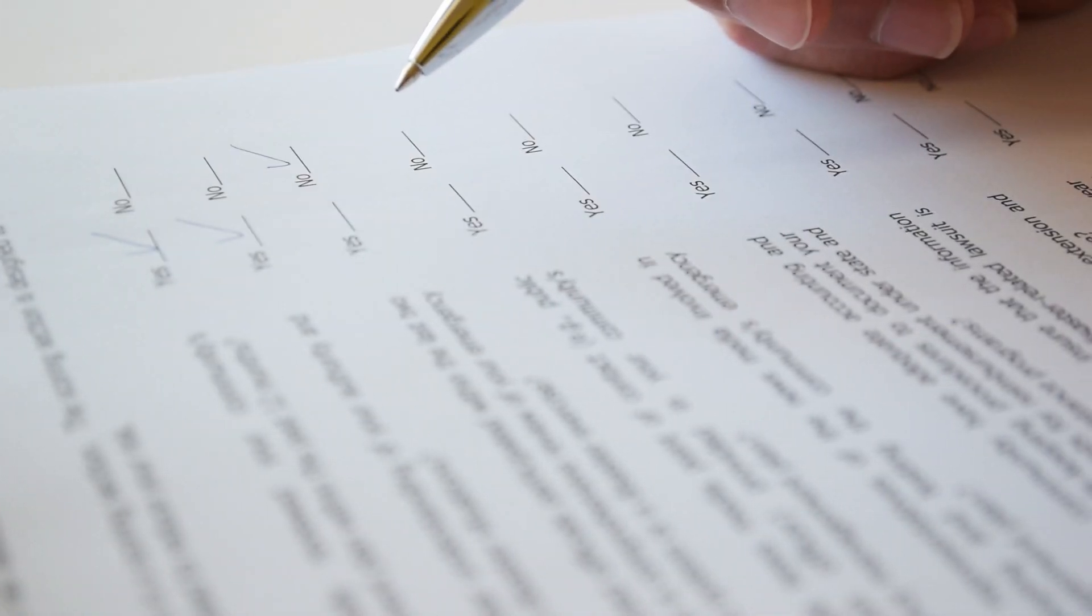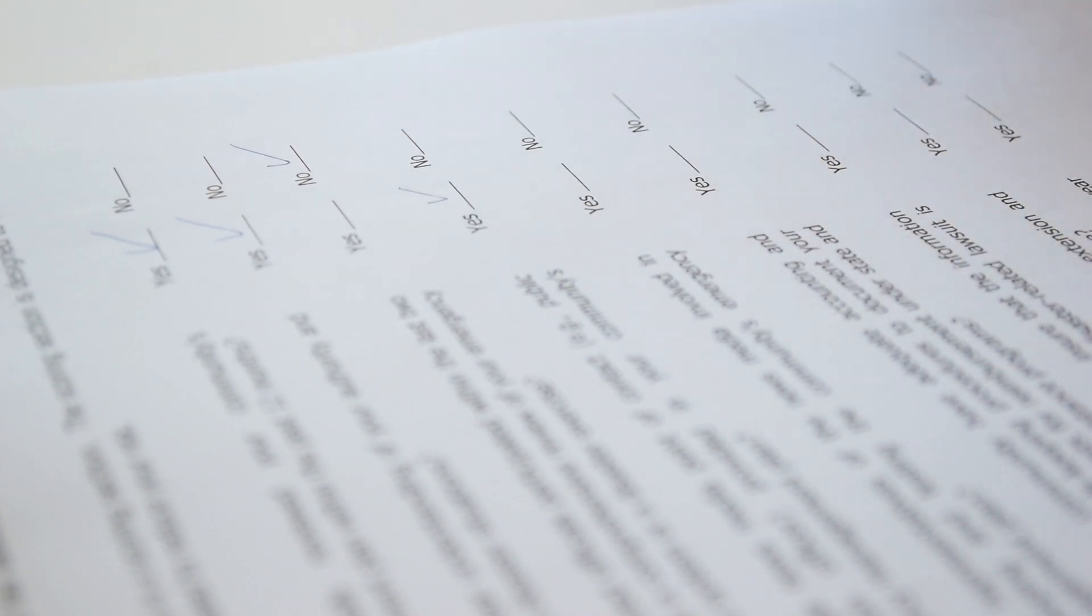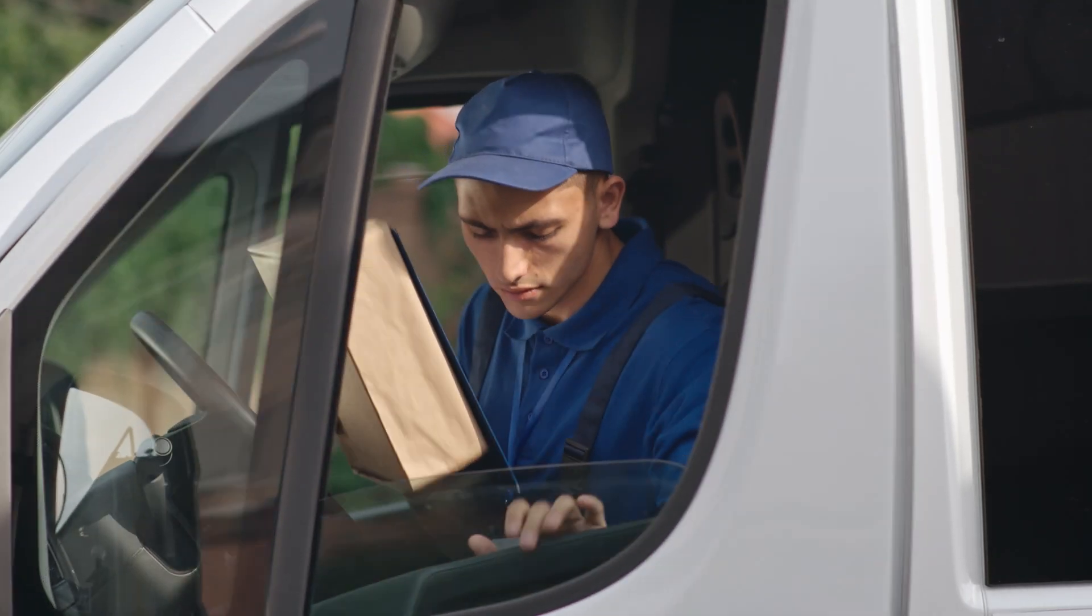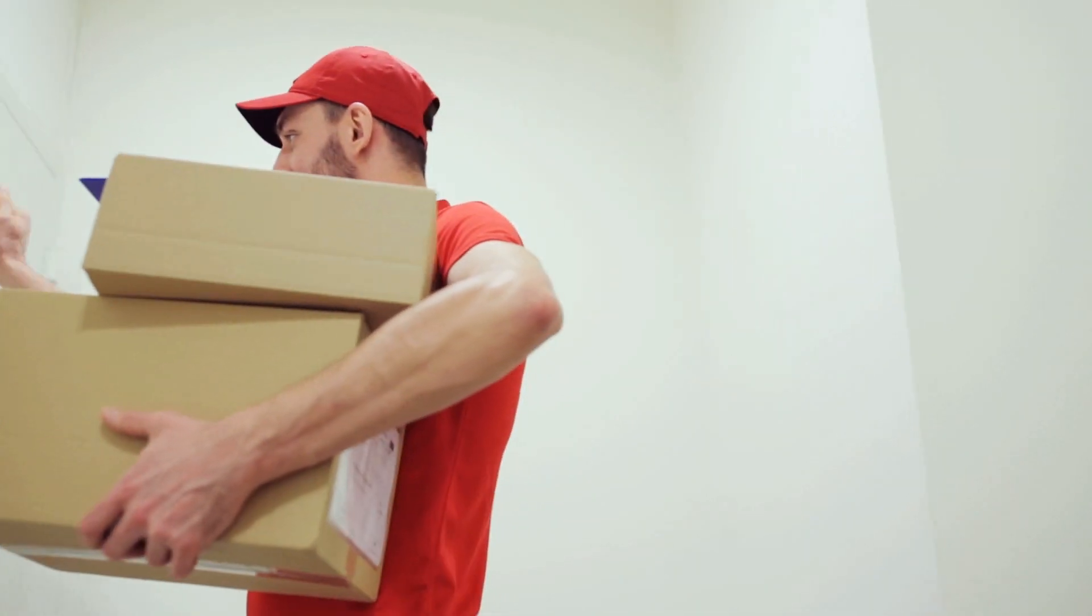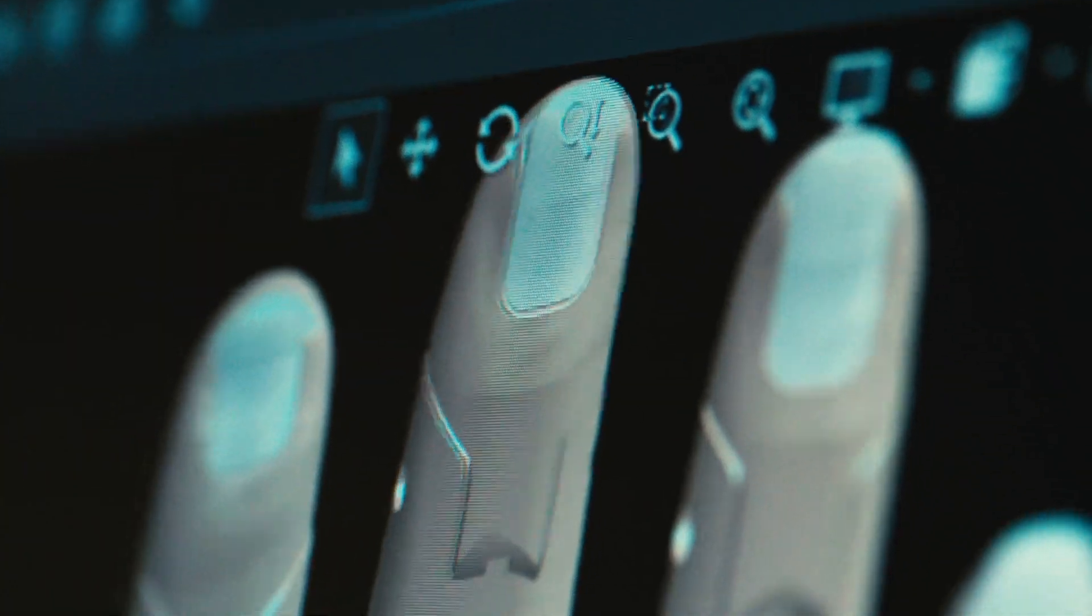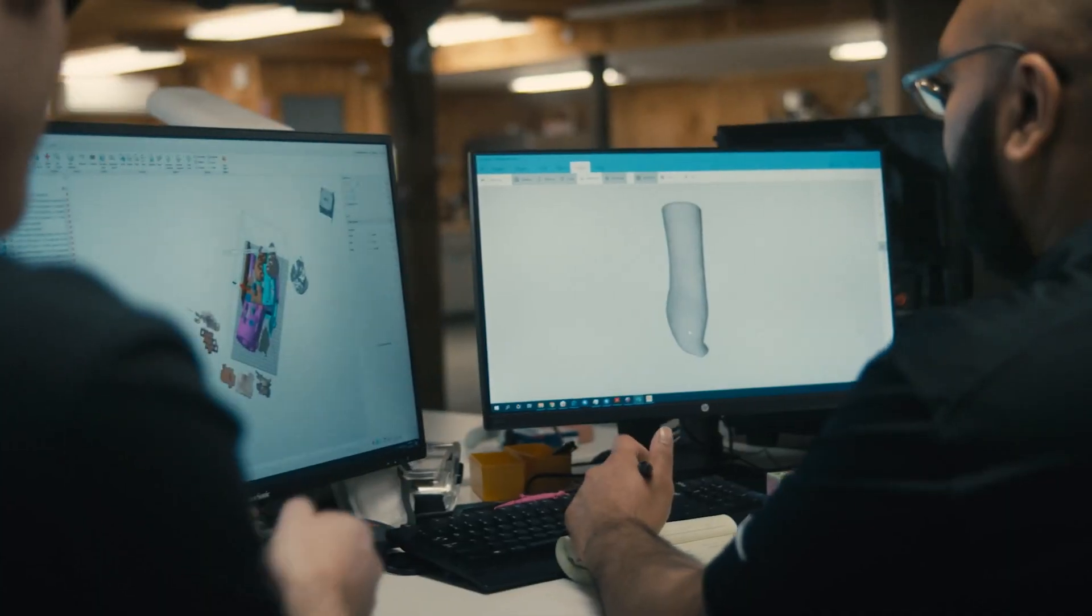First, Unlimited Tomorrow invites those who need a prosthesis to fill out a questionnaire. Based on this questionnaire, the company selects suitable candidates and sends them a 3D scanner directly to their homes, so that they can independently, or with the help of loved ones, scan a stump of an amputated limb without the direct involvement of a prosthetist.